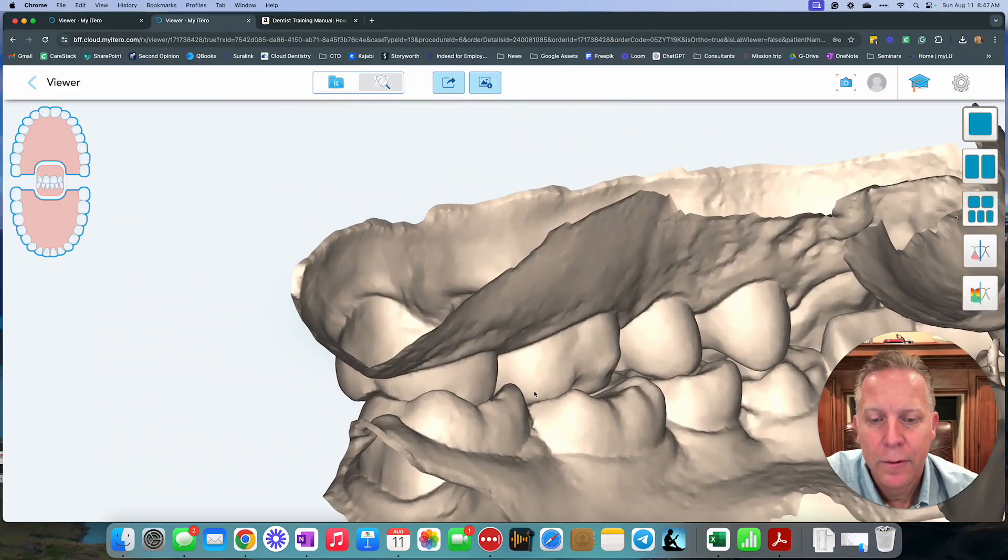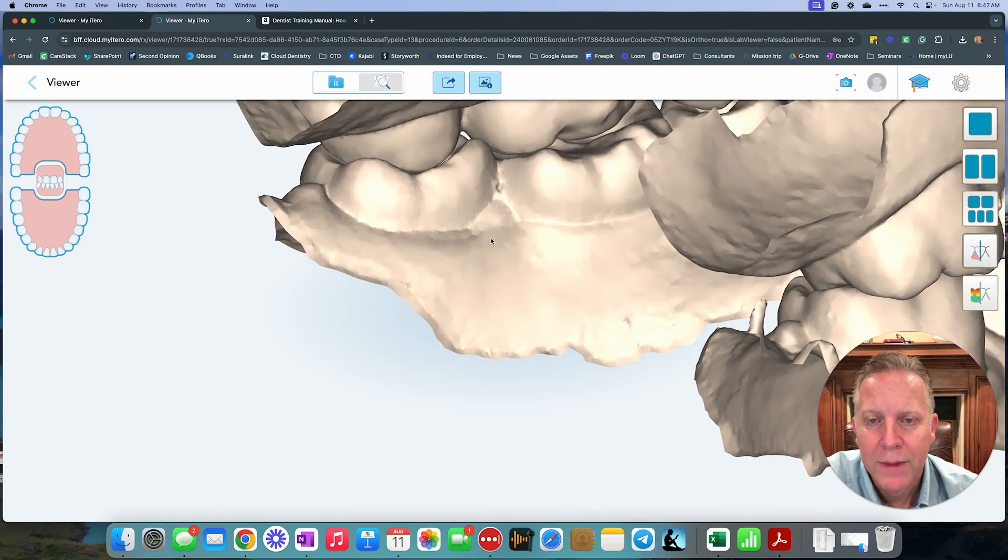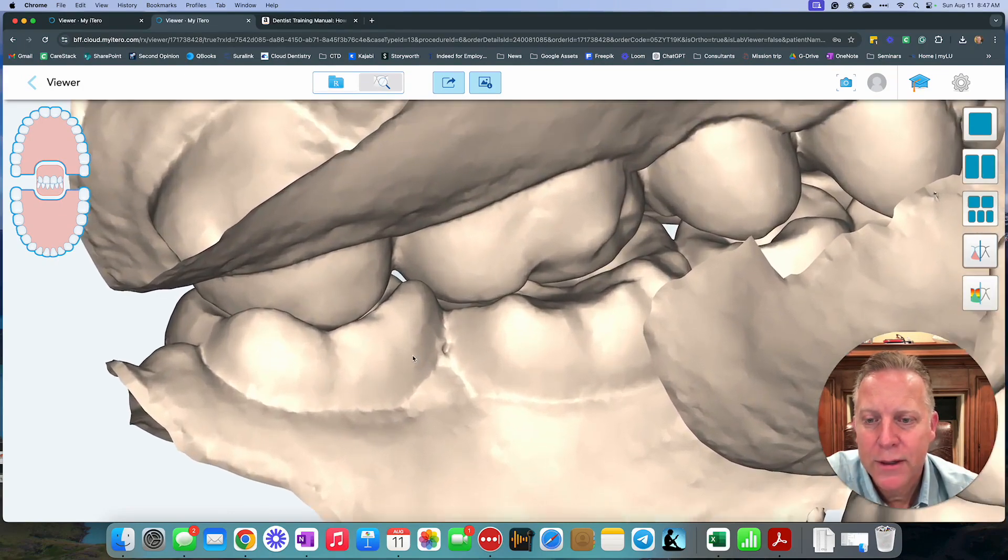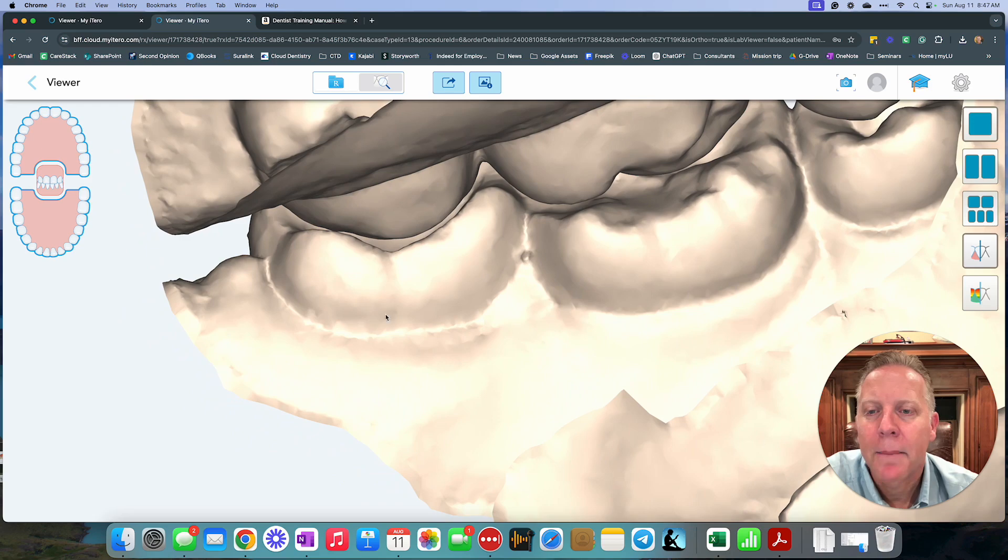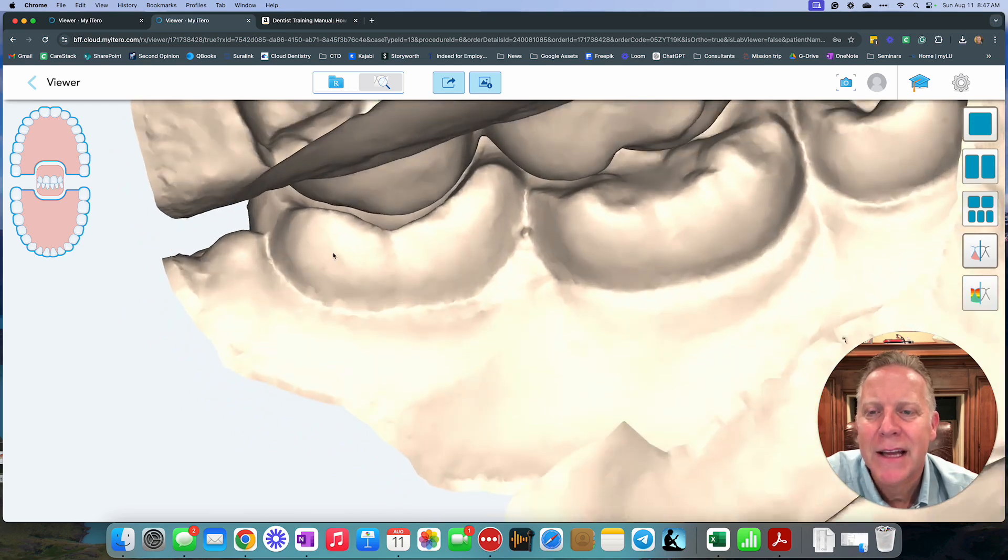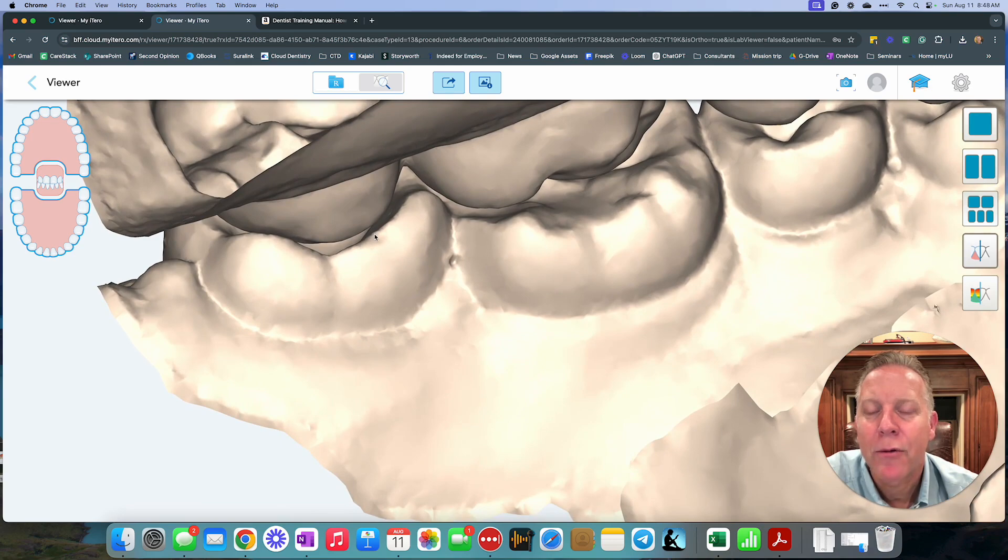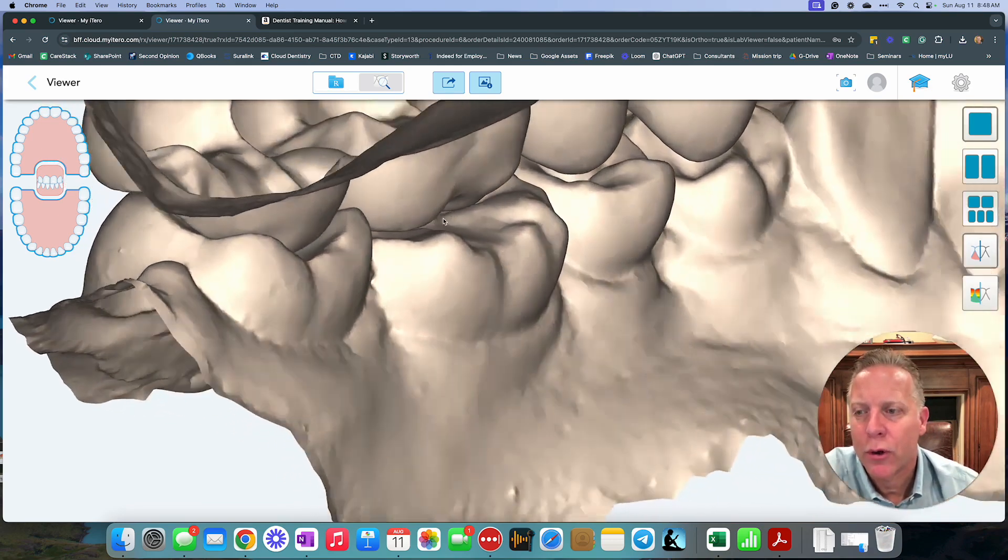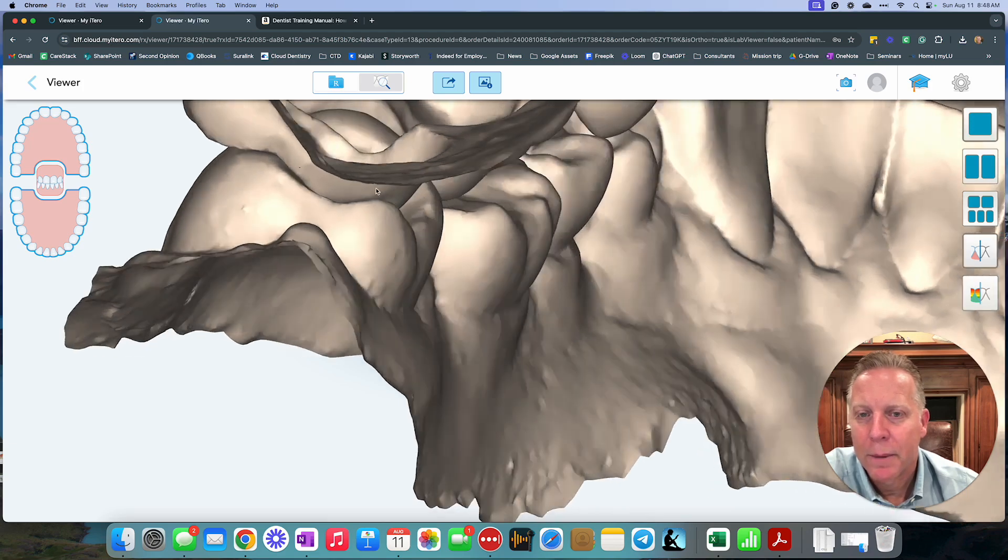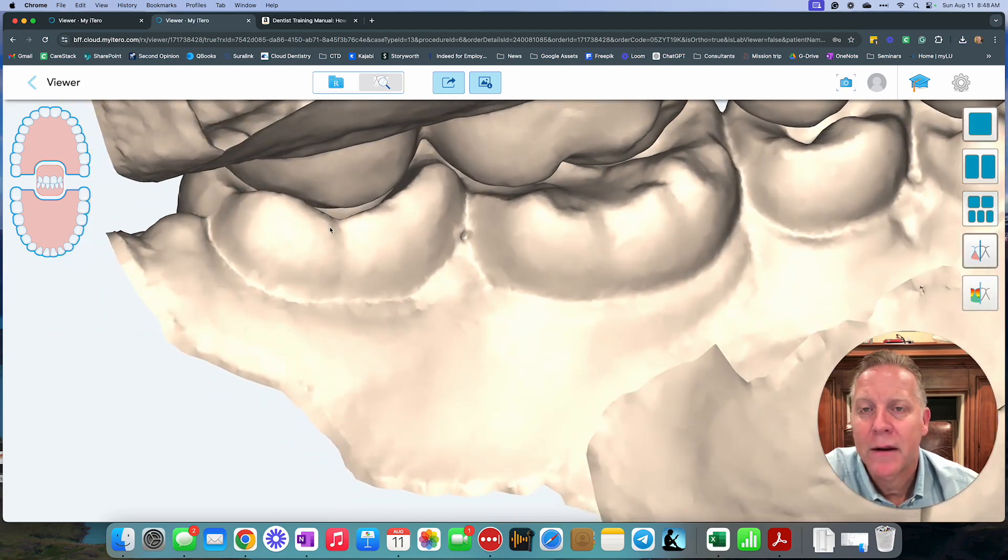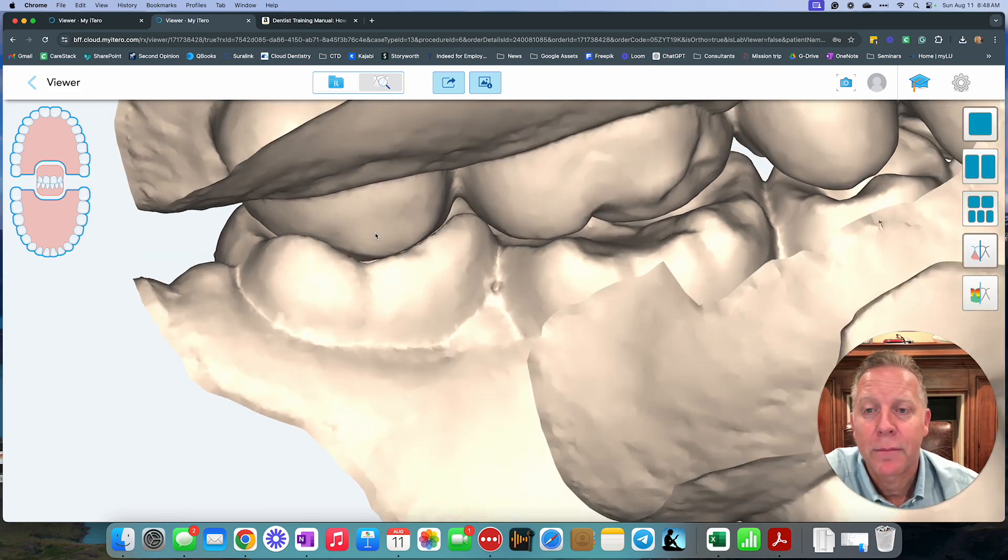Let me slide that over. You can tell it's still hitting into pretty close. We just got rid of that pointy part, and it might actually still be touching slightly. Well, maybe not that much, but I'd rather there be a little bit shy of the occlusion. Maybe there's more occlusion over on this part of the tooth, but on this inner part, we just got rid of that offending piece of enamel, and now this is going to fit better.